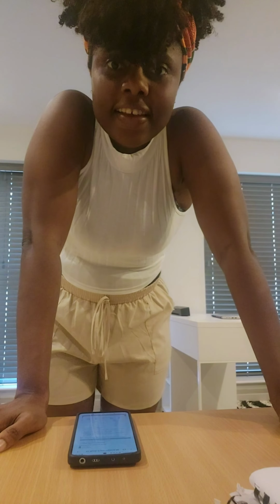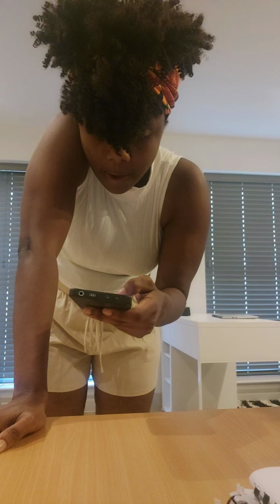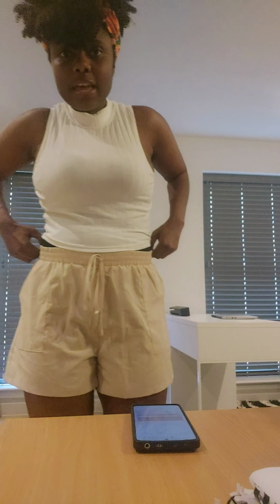So I'm going to start the procedure. I have a prescription on my phone, so that's what I'm going to read from. Alright, so I approach the scene. I check the environment, whether it's safe for my patients and myself. I need to check whether the environment is free from hazard, and I can confirm there's none, so I'm happy to proceed. I'm going to provide privacy and dignity for my patients. If it's a hospital setting, we provide privacy and dignity by pulling the curtains. But if it's a community setting, we close the door behind us.